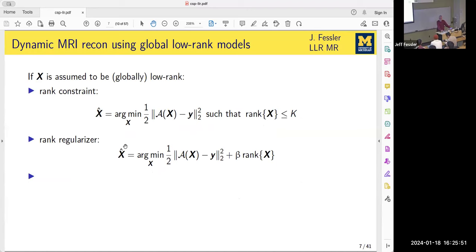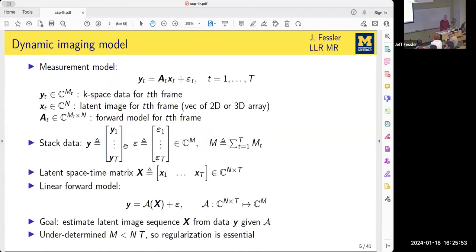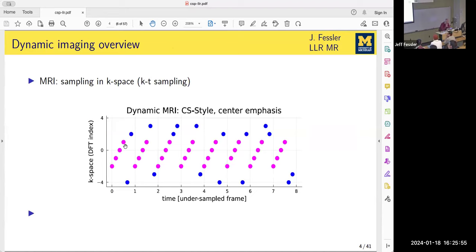Yeah, right. Back to the sampling illustration. Okay, how can we be sure that we're sampling fast enough even at the highest sampling rate? I guess fortunately we know a lot about the body, right? We know that the heart beats about once a second, and we know when we inject contrast agent, there have been enough studies that we know the typical time constants of tissue and so on.